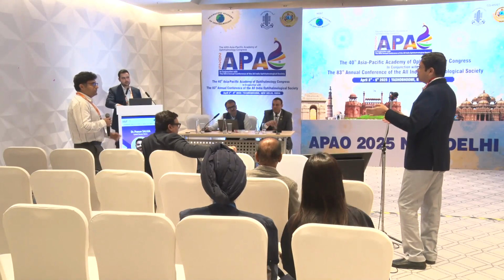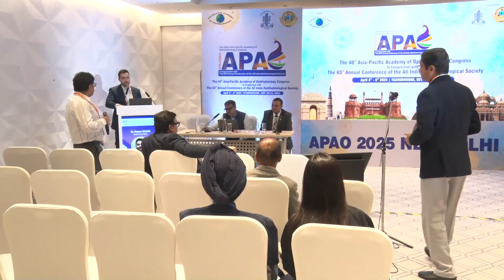I normally do not use an AC maintainer, but in such a high-risk case, yes, even if I'm doing a phaco, I have an AC maintainer from another bottle in patients who have undergone surgery earlier. I firmly believe in what you said; this is a very important point. So maintaining the chamber is probably going to be much more effective as compared to not keeping a watchful eye on that. What about you, Somil? How often do you operate for non-resolving cystoid macular edema?